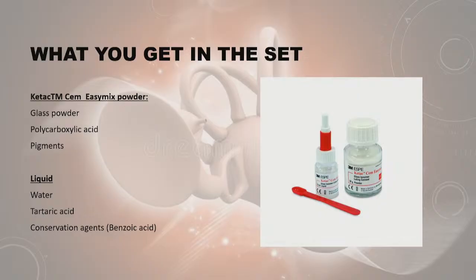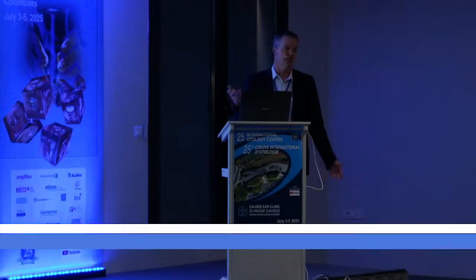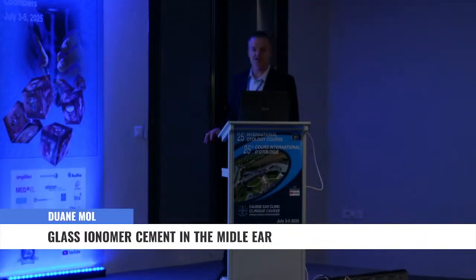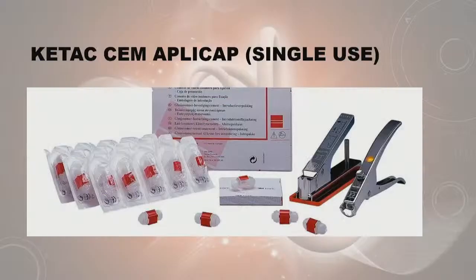So you say, ooh, that's a bit fast. So the nice thing is we can remix during the case. We often remix 3 or 4 times, make a new little set each time. The guys in Europe said, Dwayne, we need this to be sterile. So I was very excited when they brought this out.